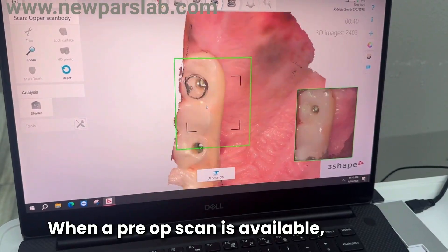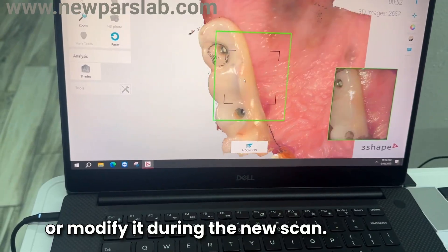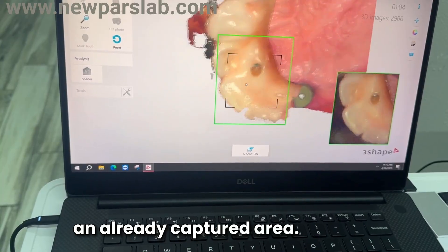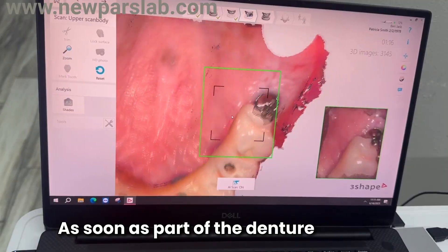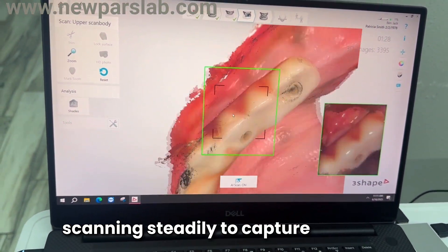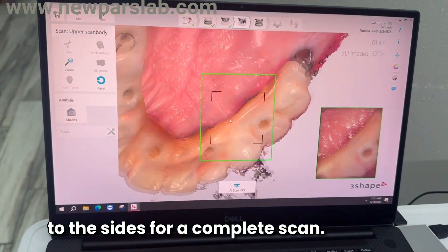When a pre-op scan is available, the scanner will attempt to align or modify it during the new scan. Begin scanning from an already captured area, then gradually move across the denture. As soon as part of the denture appears on screen, continue scanning steadily to capture the entire surface and extend to the sides for a complete scan.